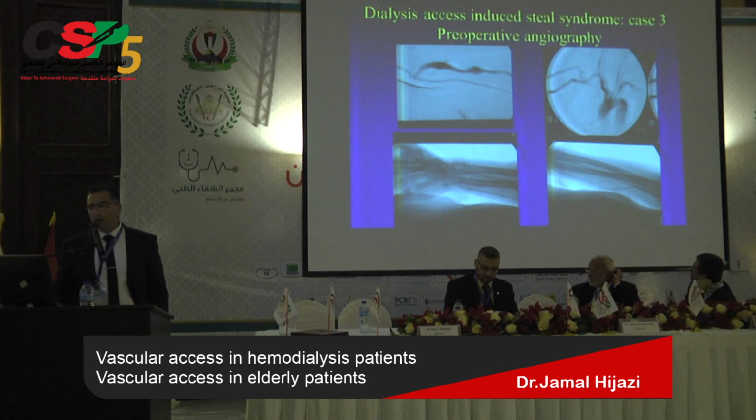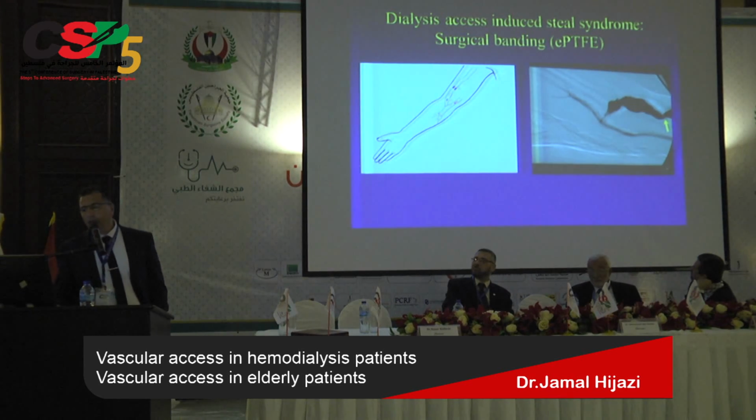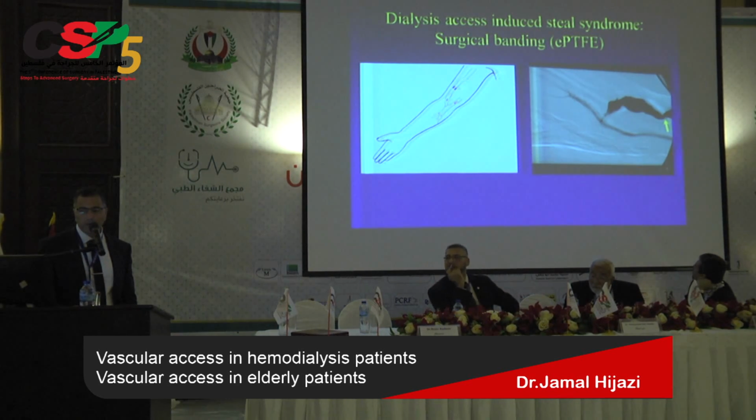So what we did for him was a banding, just to decrease the flow in the fistula, and sometimes this resolves the problem, to reduce the flow.